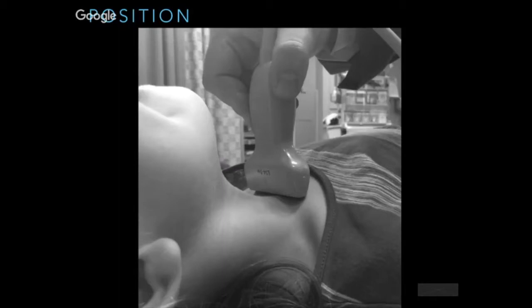So your trauma patient comes in, obviously they're going to be supine on the gurney. When you want to check where their ET tube is if they're intubated, you want to use your high frequency linear transducer and you want to be just at the sternal notch. That's the best place to be able to see the anatomy that you're looking for. Remember to put a little bit of gentle pressure, so you can see the esophagus move out, most commonly to the left. And that way you can see your proper anatomy.